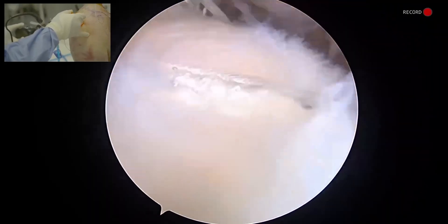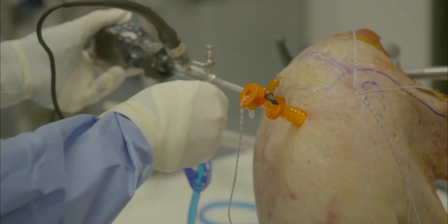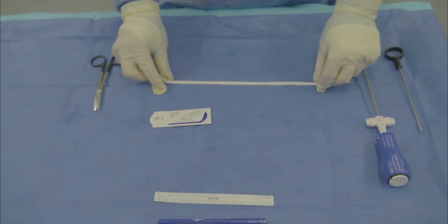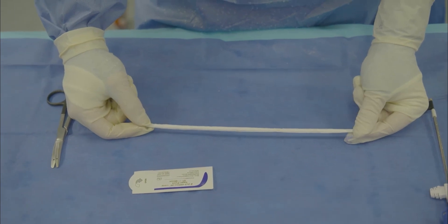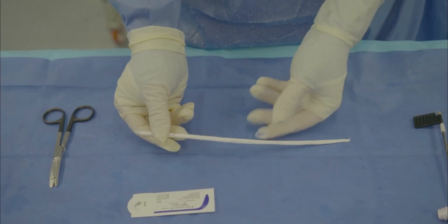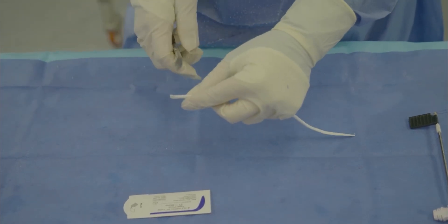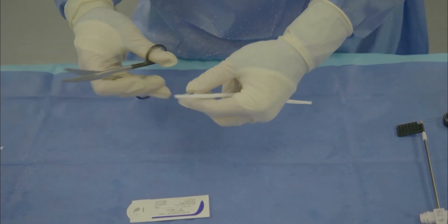Before I do that, because of the poor quality of the tissue, I'm going to augment this repair using a BioBrace, and I'll show you how we prepare that. We're preparing our BioBrace strand for cuff augmentation here. We have a 5x250 BioBrace, which is a collagen reinforced with PLLA, and we're going to prepare this for augmentation of our rotator cuff repair. The ends of the BioBrace are tapered in order to be able to pass and prepare it.